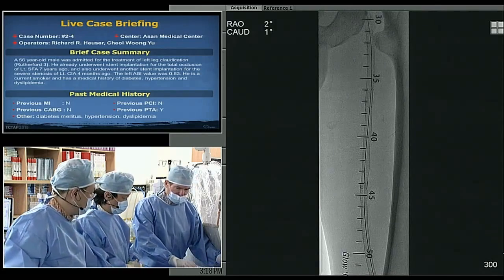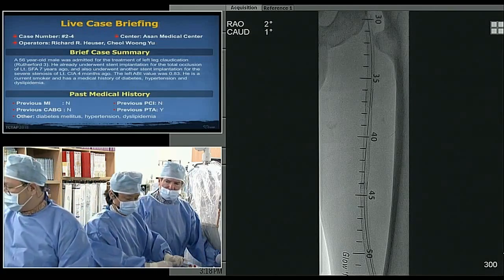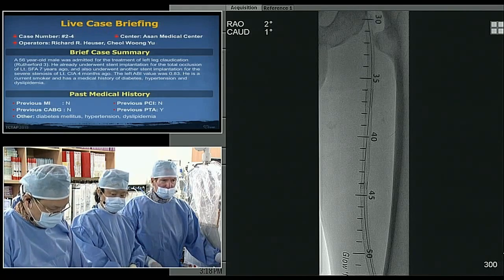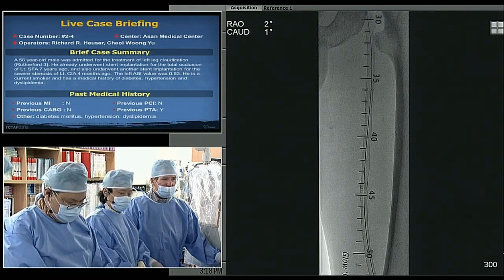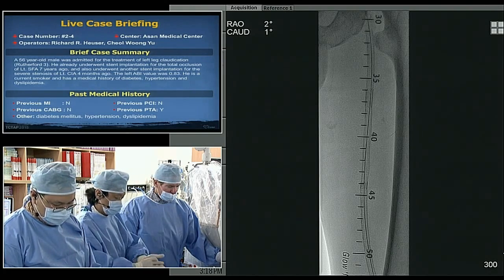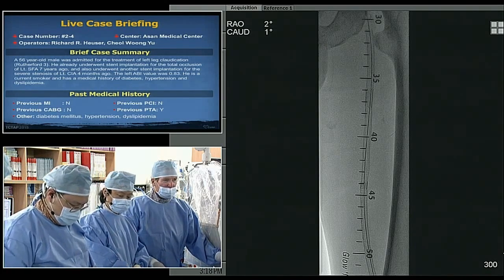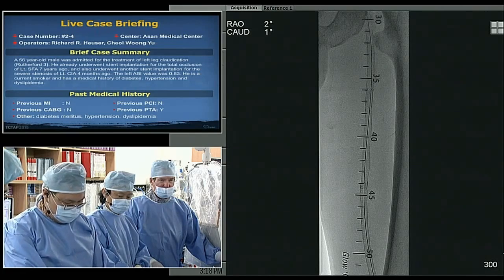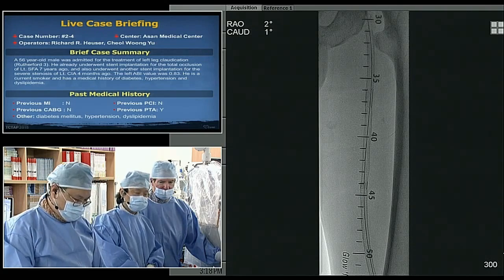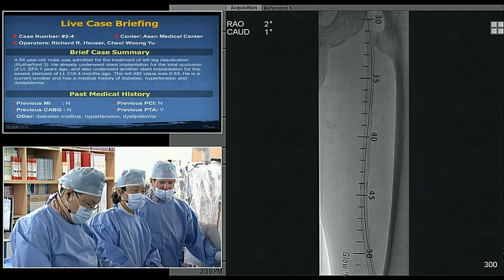I have a question for you. During the procedure using Rotarex, do you need a distal protection device? Oh no, we don't use it because the aspiration strength of the Rotarex is so high that we don't experience any embolization during the Rotarex passage. Sometimes I use a filter after additional ballooning if I cannot remove all of the occluding material out of the vessel, and if there is something suspicious, then for the balloon I use the filter.